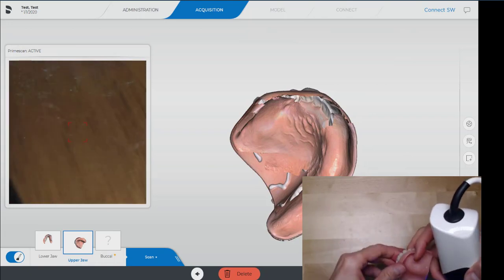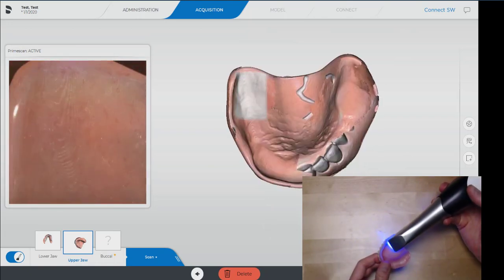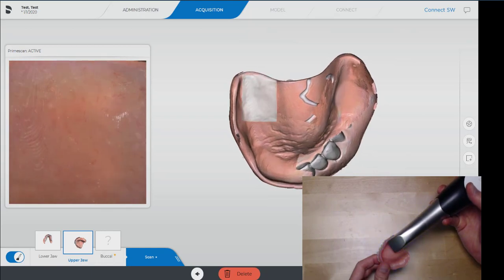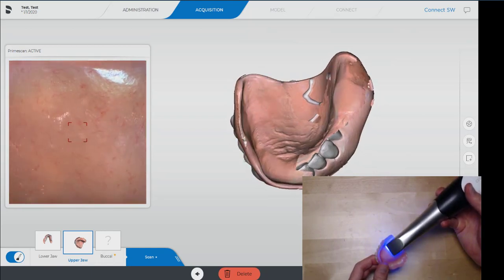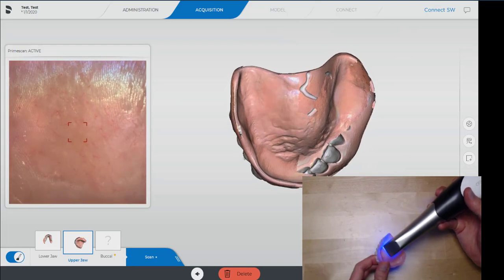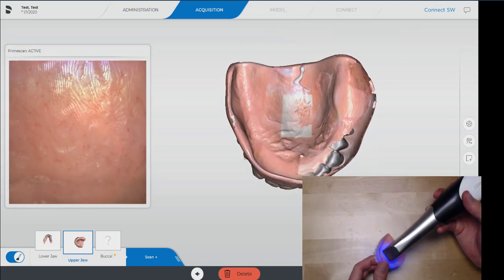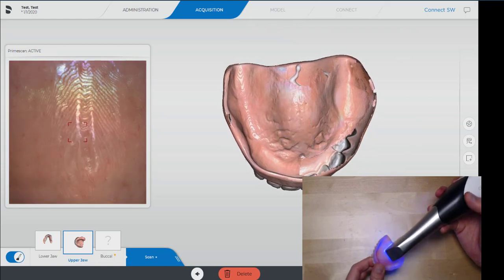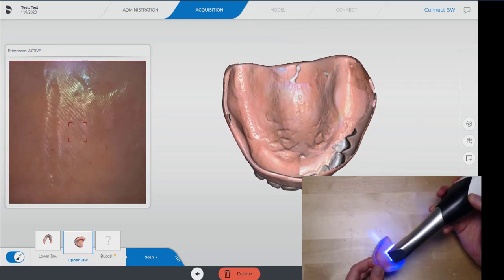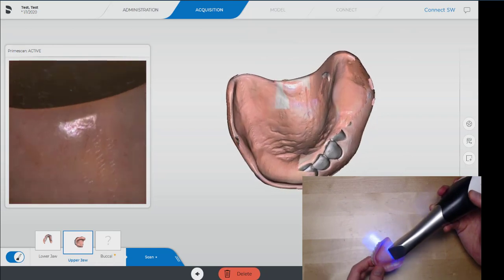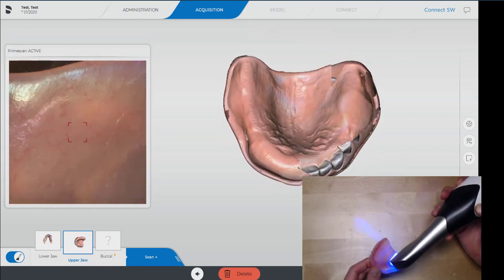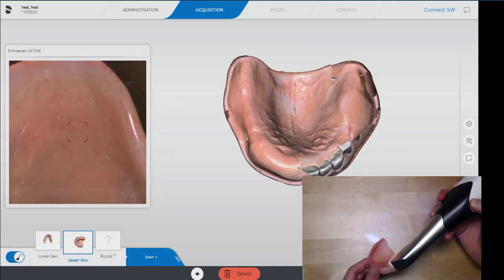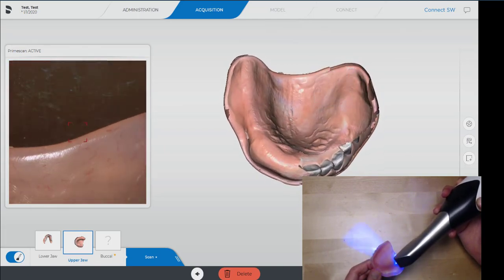I've found if you're doing this with a wash impression, there's a little more texture to it, it's a little easier to scan. You can certainly spray these as another way to do it. I'm not opting to do that today. And then you can also put your liquid dam on the inside as well. A lot of times I'll choose to do that, but today we're just going without it.